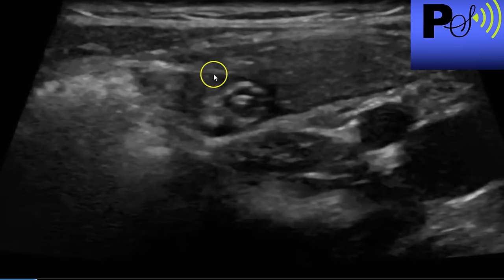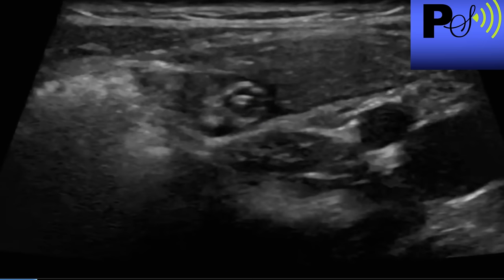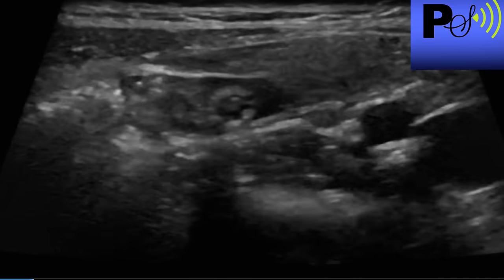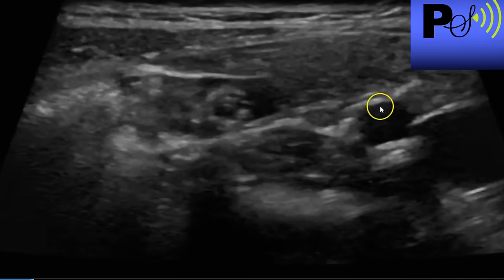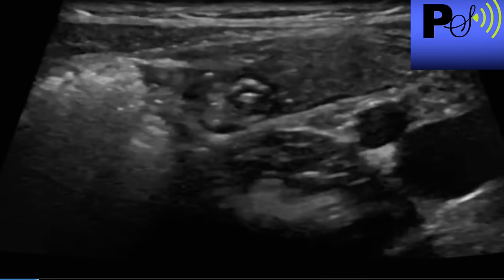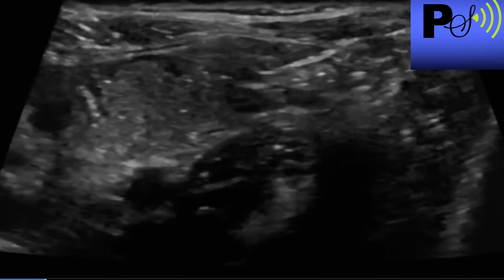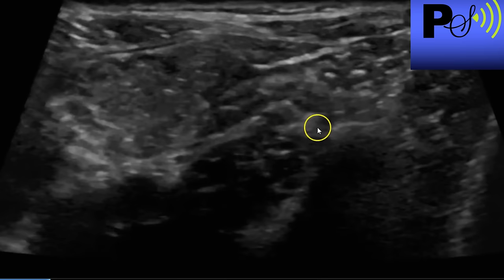There's a tiny bit of free fluid — it's about three, three and a half millimeters. It's normal. Over here again you can see the iliac artery and iliac vein. Just posterior to it you'll have the psoas muscle.